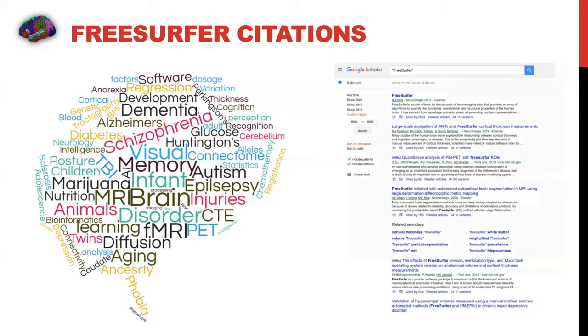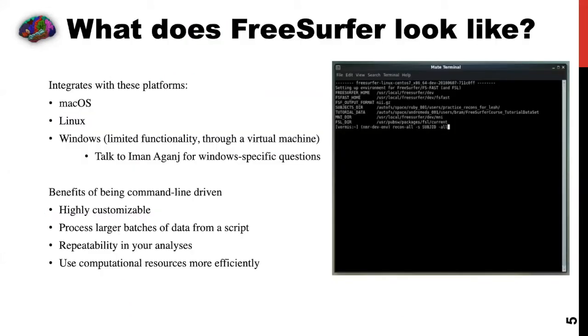In this day and age, we're used to our beautiful interfaces, right? If you're using Safari on a Mac, you click the download button, you get a little notification and there it is. You work with software that way. Whereas FreeSurfer operates out of a terminal, which I think we typically associate with hacking or code or, I don't know, bank robberies. At least that's how I interpreted it when I first came to the lab.